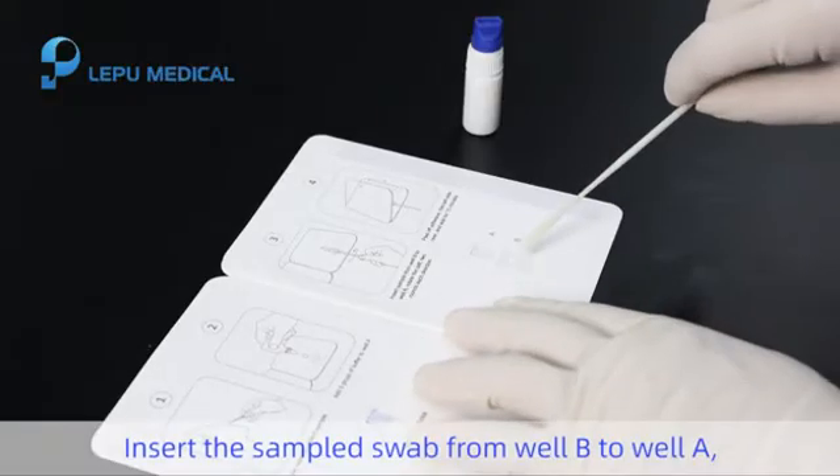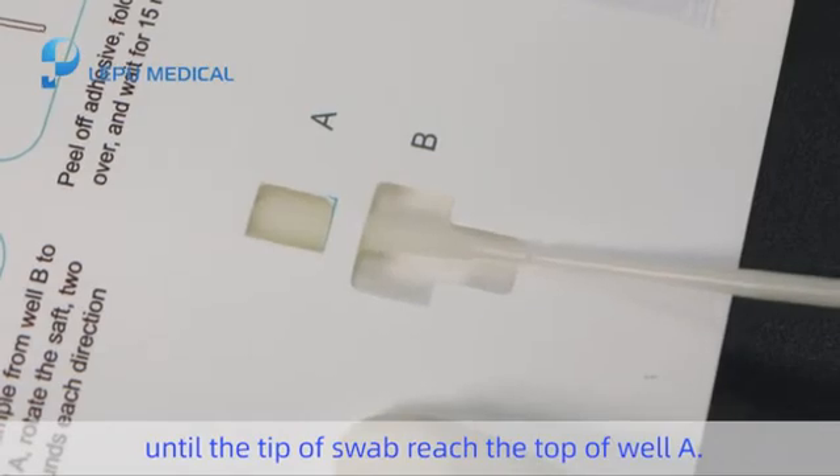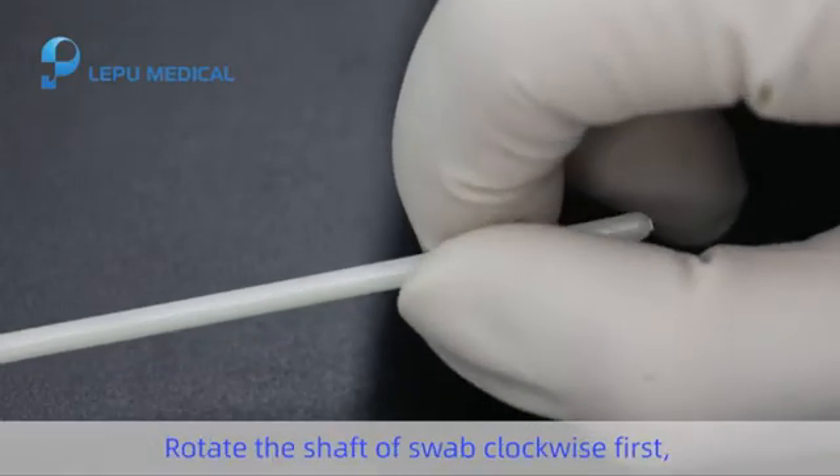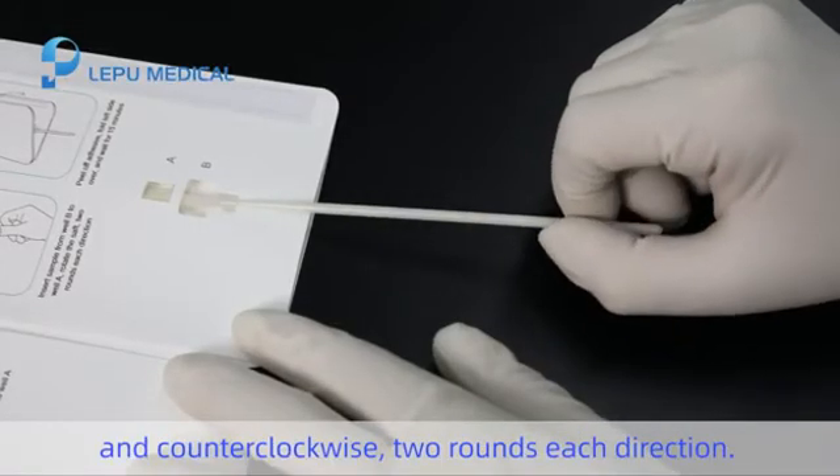Step 4. Insert the sample swab from well B into well A until the tip of the swab reaches the top of well A. Rotate the shaft of the swab clockwise first and then counterclockwise, two rounds each direction.